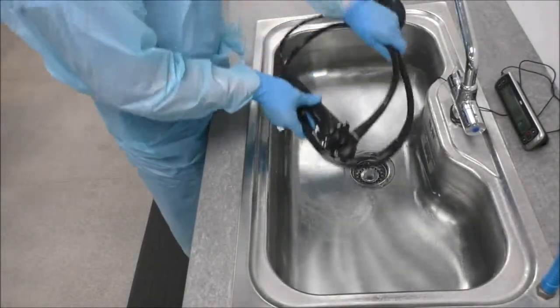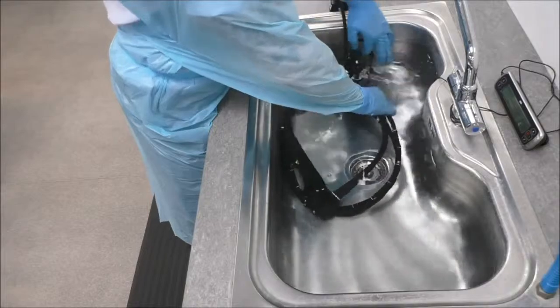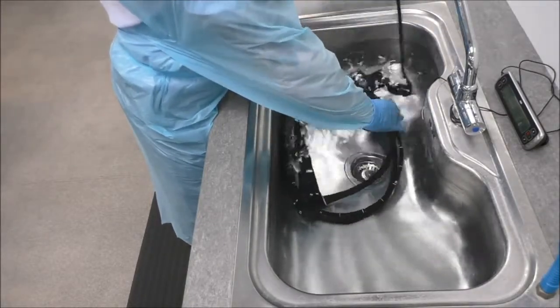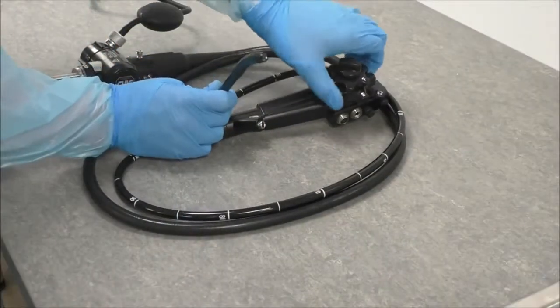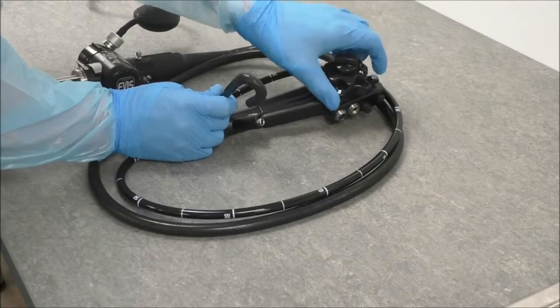Then, transfer the endoscope into a basin of clean water, ensure the endoscope is fully submerged and the leak tester remains outside of the water. For videoing purposes, the checks to carry out during a leak test are being done outside of the water.